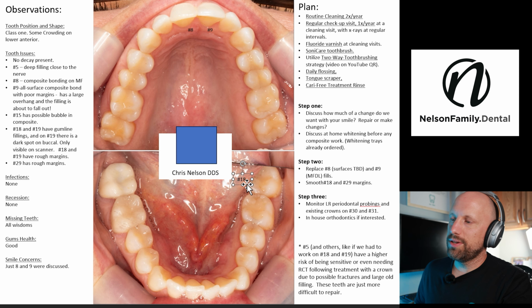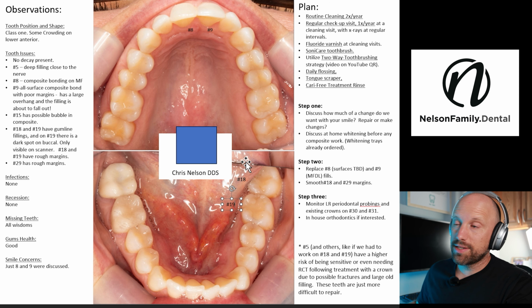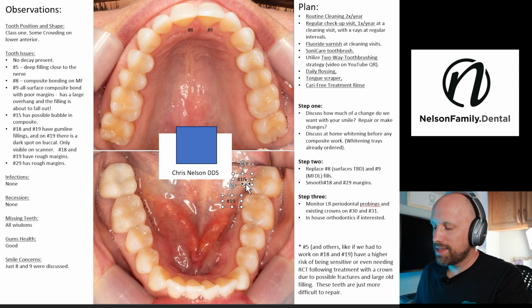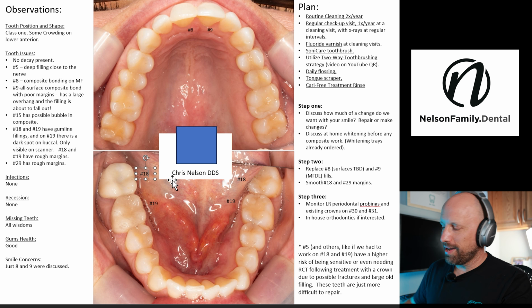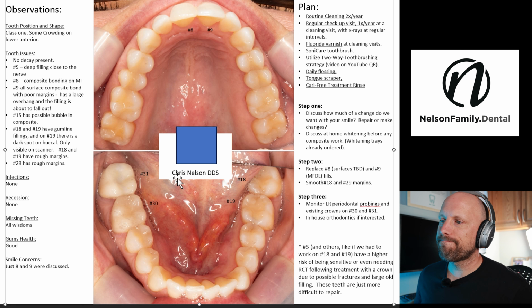I hope that you're finding this video helpful and you're learning either about treatment planning as a dental student or another dentist. You can see how we do our new patient process. We do this for every new patient, or you're just somebody who wants to learn about teeth. And if you're a dentist and you think that this is a waste of time, or you have a different way of doing things, I'd love to hear about it, because this process developed out of what my dad did, what my grandpa did, and is an evolution of that.